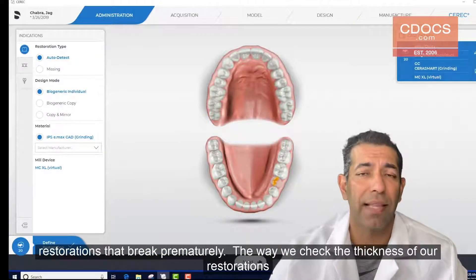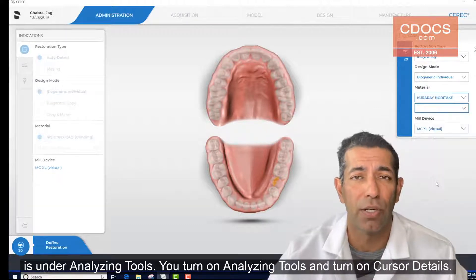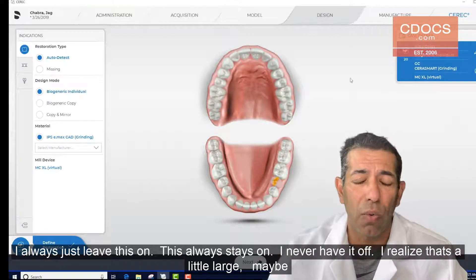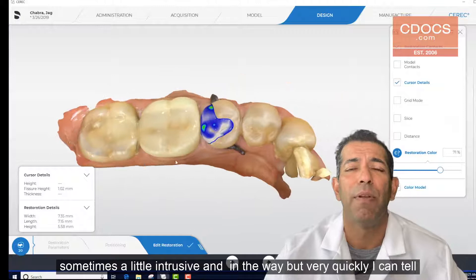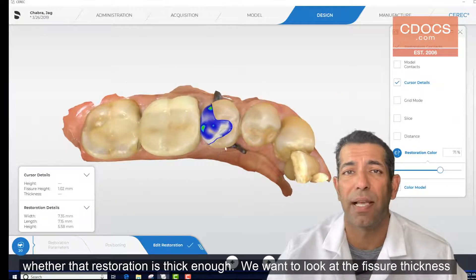The way we check the thickness of our restoration is under analyzing tools — you turn on cursor details. I always just leave this on; I never have it off. I realize it's a little large and maybe sometimes a little intrusive and in the way, but very quickly I can tell whether that restoration is thick enough.